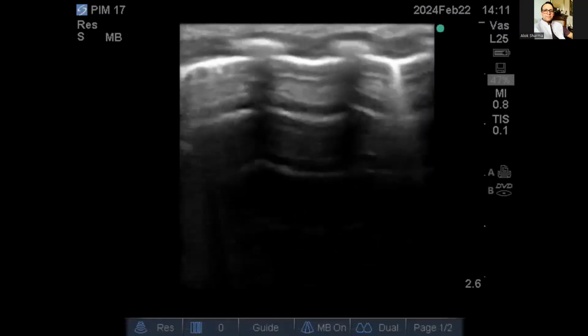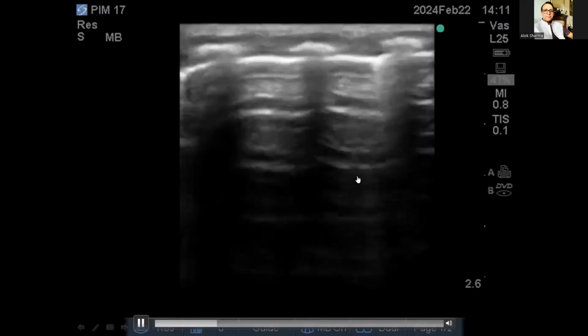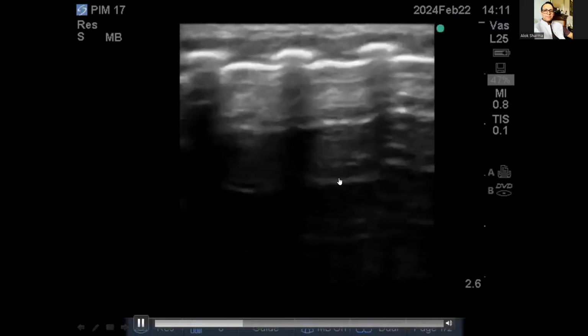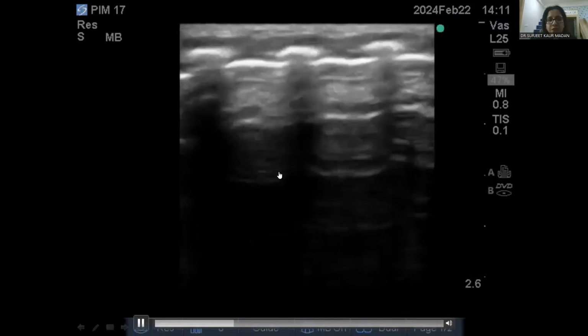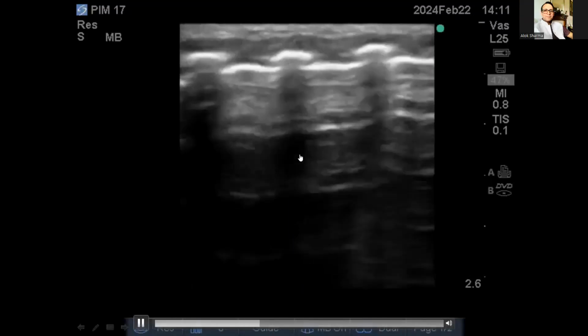So for the anterolateral scans, your standard scan should have all your regions R1, R2, R3, R4. If you're doing anterolateral, they all should have M mode. And this is R3, R4, and I didn't get a B profile there. And I don't have subpleural consolidations.